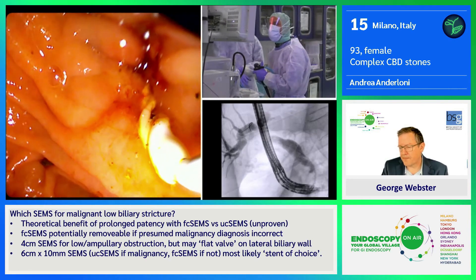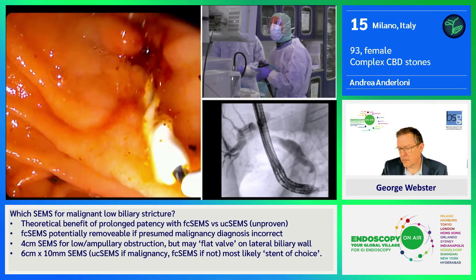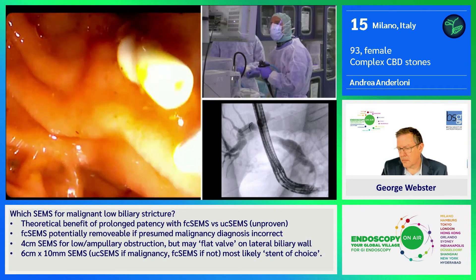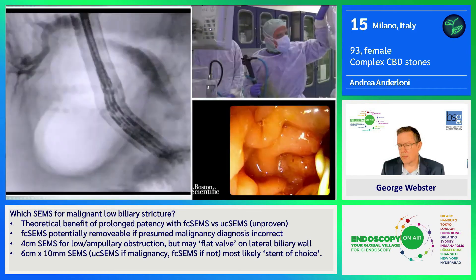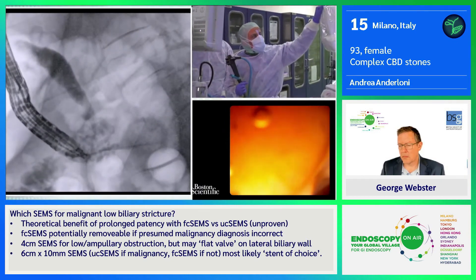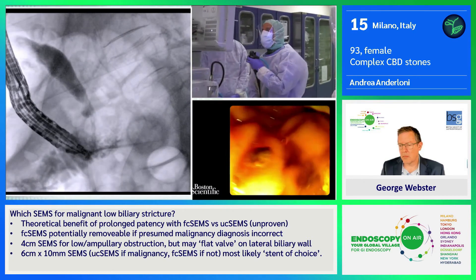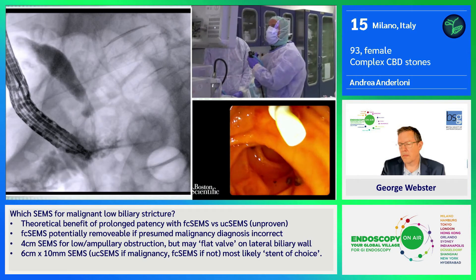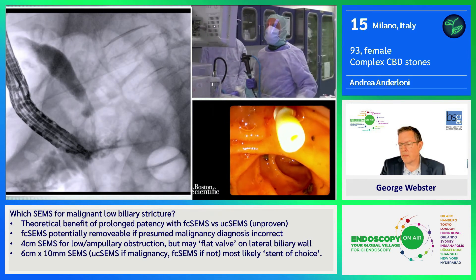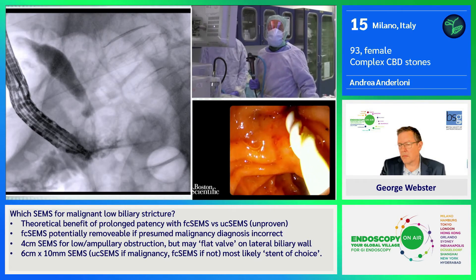I am ready now to remove the guide wire. If you take a look endoscopically, you can see that the stent is fully released just now. You can pretty much recognize the chain shape of it. The procedure is finished. The lady does not have any more stones in the common bile duct, and more importantly, she's not going to come back to remove the stent.